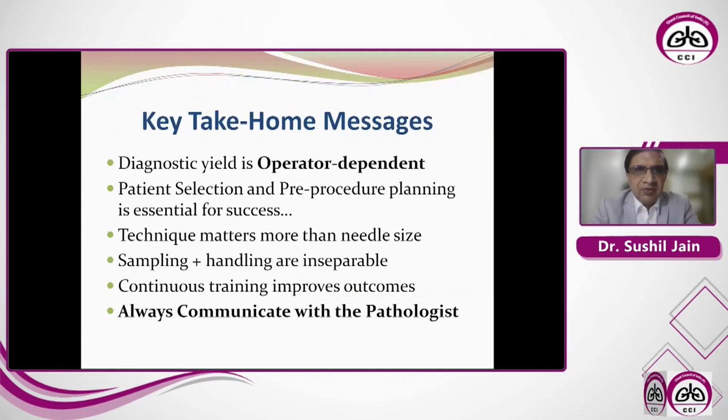Now I come to the end of my talk today, and the key take-home messages are: diagnostic yield is operator dependent. Patient selection and pre-procedure planning is essential for success. Technique matters more than needle size. Again, the very important thing for the beginners to understand is that you need to improve on your technique. Needle size most of the time does not matter much.